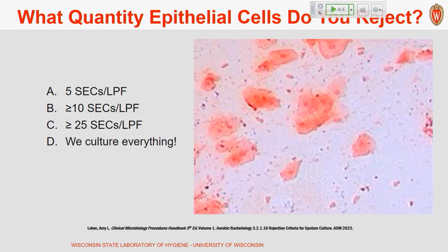I remember him saying you don't need the WBCs, because if there are squamous epithelials, it's the same with urine culture. If you've got them in there, it's a bad sample, and the predictive value has gone down. They might still have pneumonia, or they might have a UTI. So I think it makes sense that you don't just go by the squames.